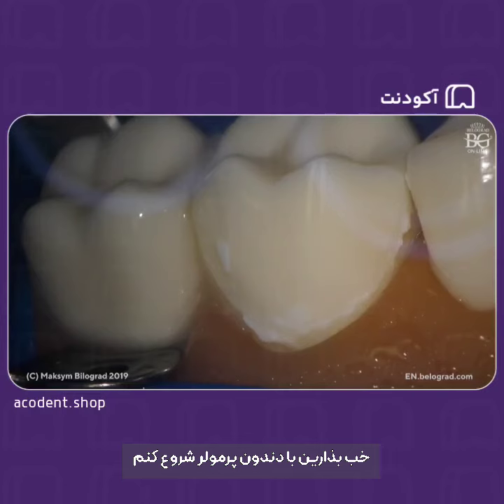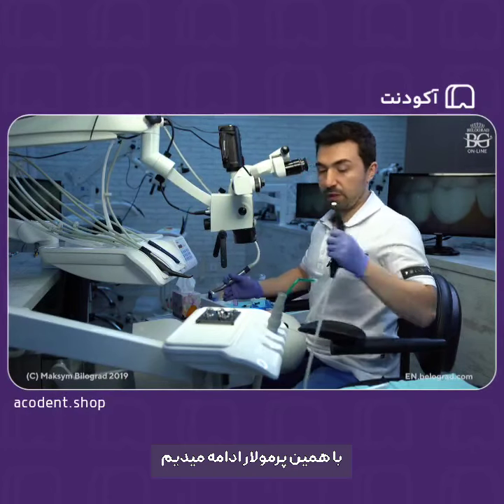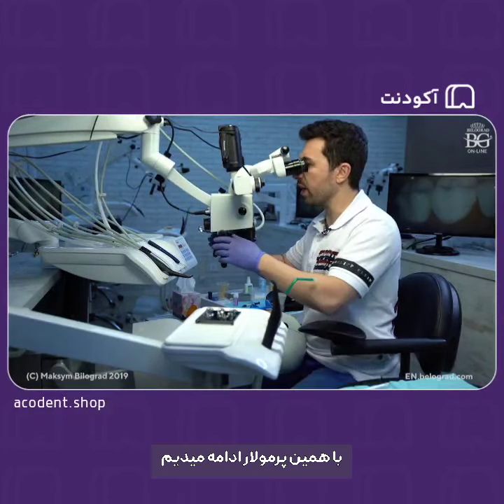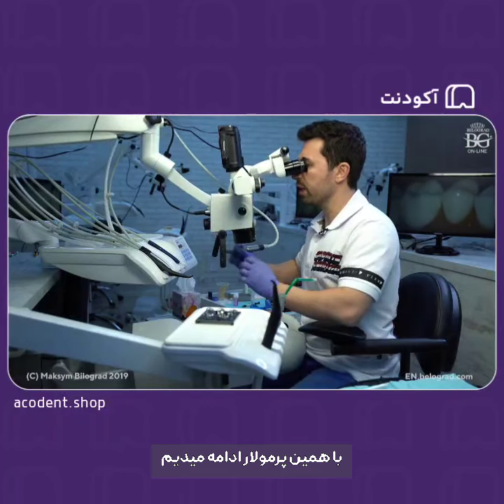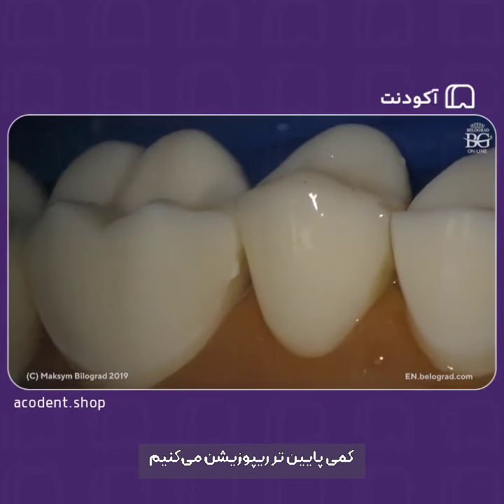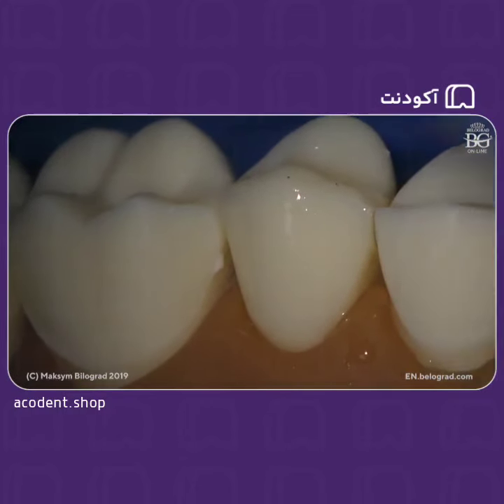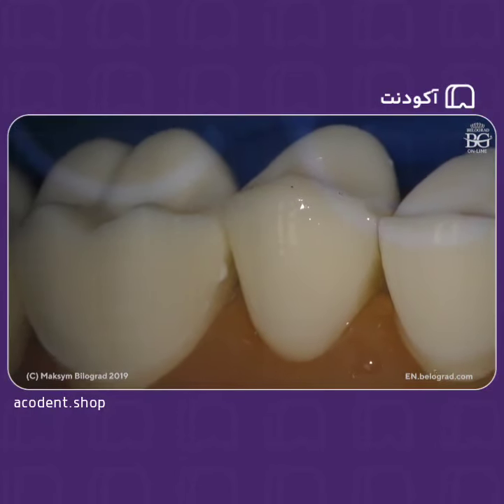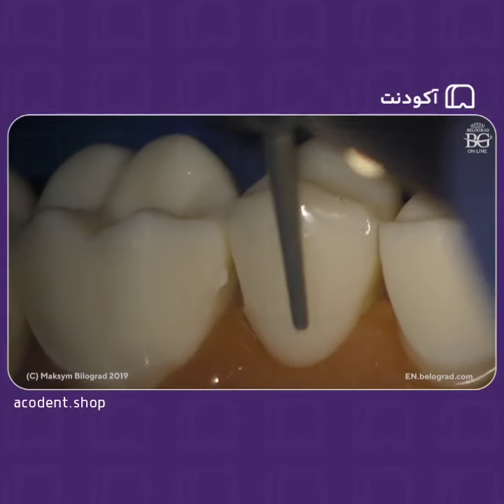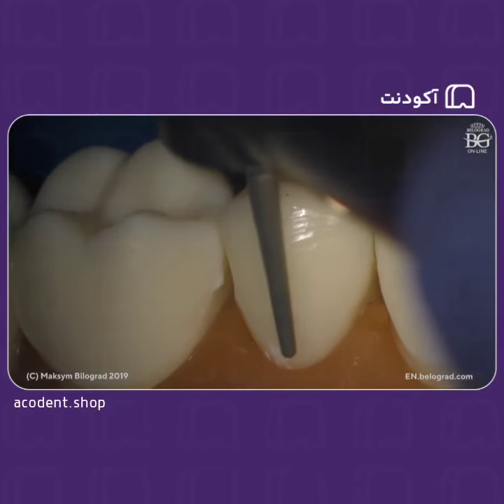Okay, so let me continue with the premolar. Let me just rinse and dry this one. Okay, fine. So we can continue with this premolar, and the same sequence. We just reposition the cervical finish line a little bit more down. Is it in focus? Not really. Yeah. So let's go. Move our finish line more down.